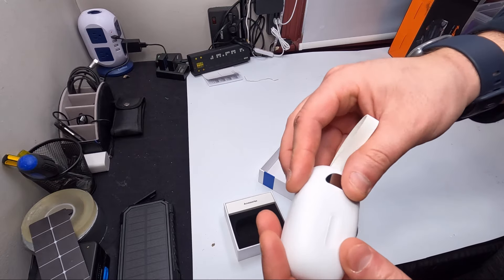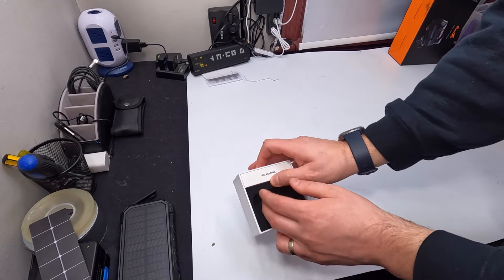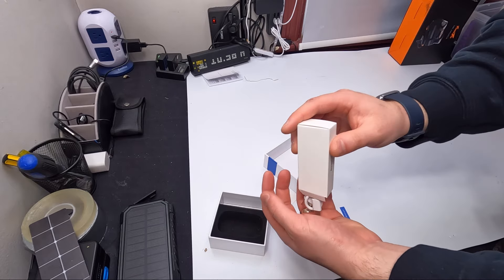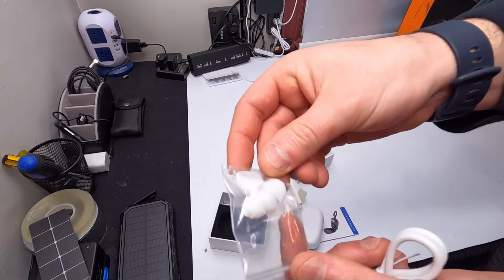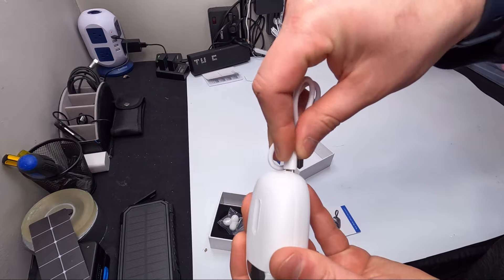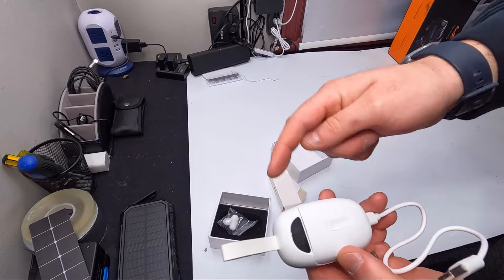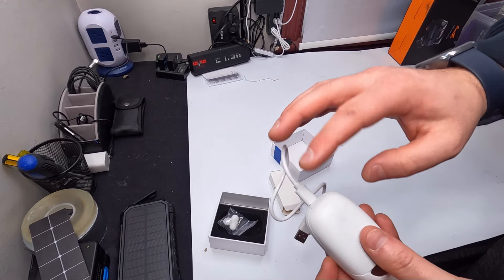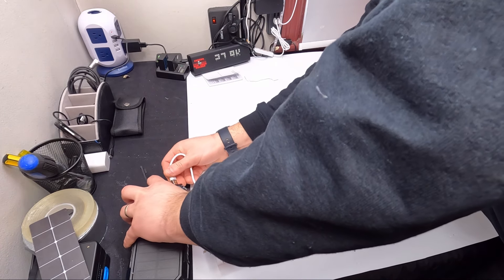They charge inside this case. They provide you with the power cable and also different earbud tips. You charge this with the Type-C cable — just plug it in and then plug it into any USB outlet and it charges the case.